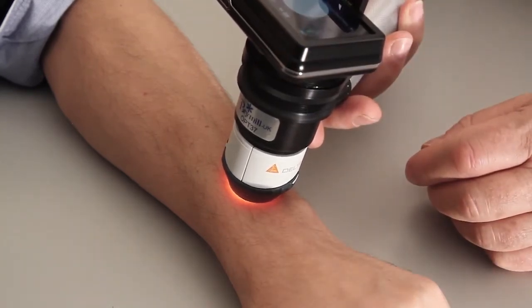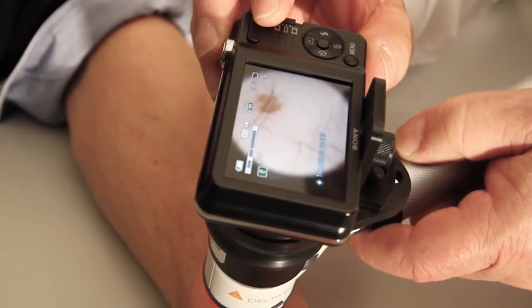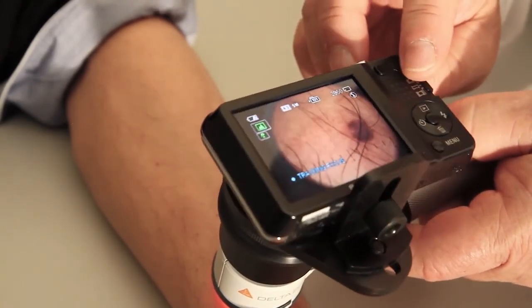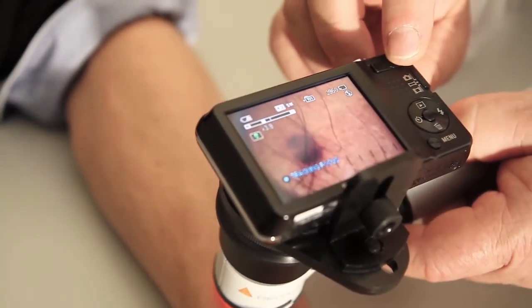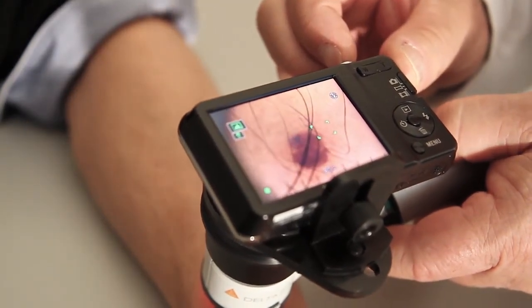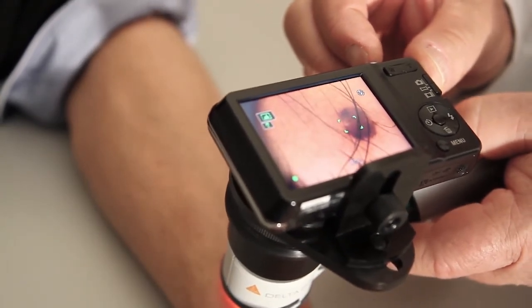Now, the first thing to do is to expand the image so that it fills the screen as much as possible. So you need to expand it a bit further with that little lever on the right hand side at the top of the camera. Bring it up like this, and then orientate the camera if you can, always moving it clockwise so that it stays in focus, so those graticules are nice and neatly along the bottom of the image. Make sure it's nicely centered as well.